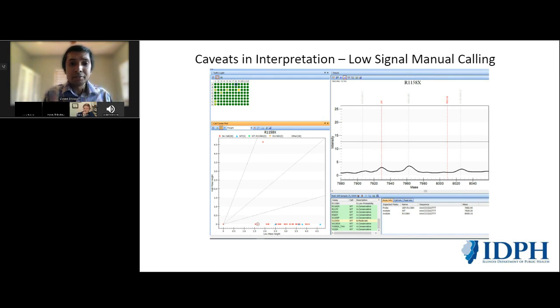And obviously, this could be because some of the DNA blood spots that we receive aren't totally pure. The extraction may not have worked as ideally. Ideally, when you're using pure DNA, these mutations light up perfectly. However, when you're dealing with real clinical specimens, you're not always going to get that perfect specimen. And so sometimes you'll have to deal with less than perfect conditions in which you're making some of these calls.